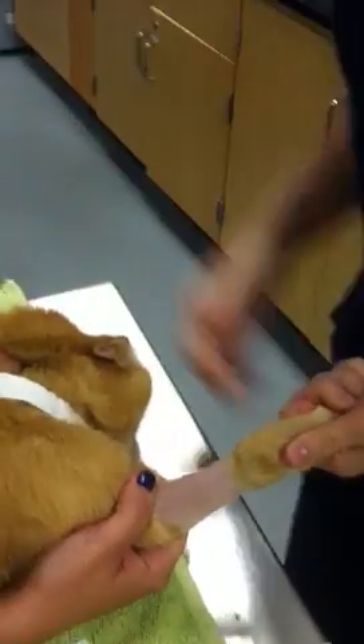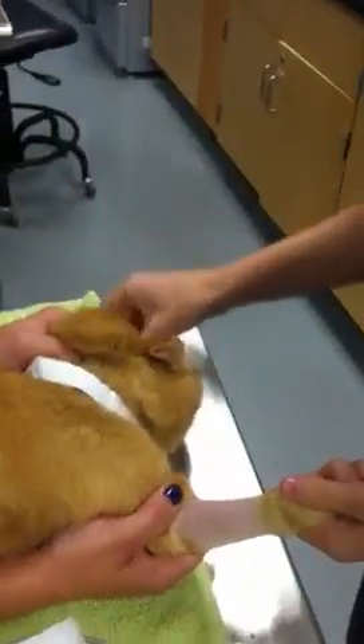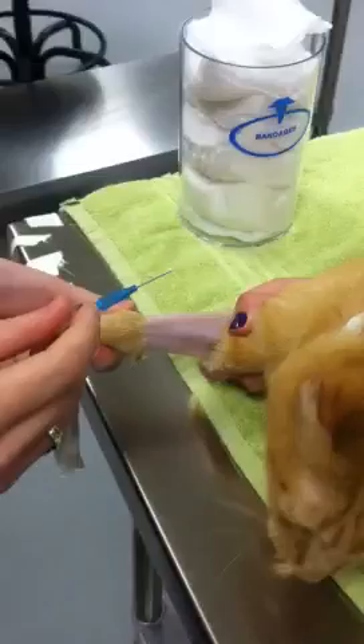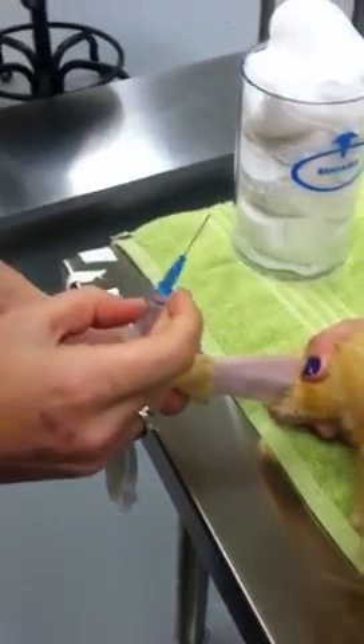I have my catheter here — it is a 22 gauge catheter that we'll be placing in this cat. I'm going to place it in the cephalic vein, but before doing so I want to make sure that my seal is broken just so it's easier to push in.